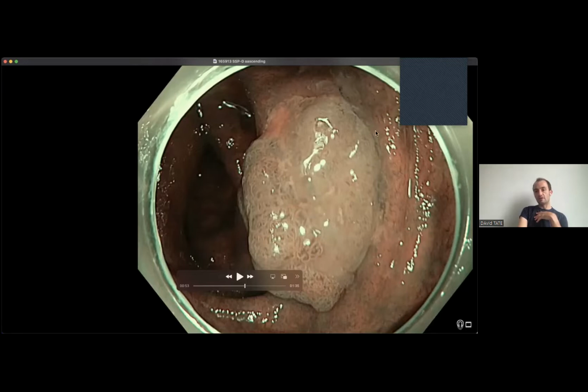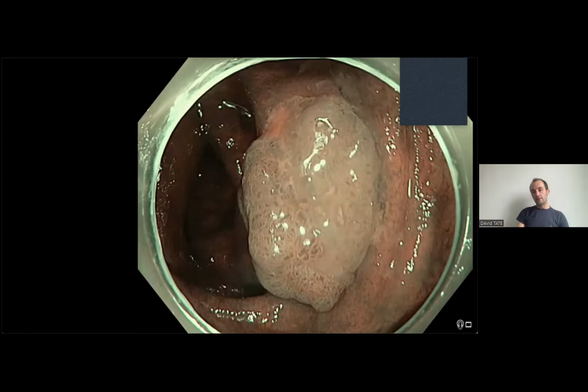And this is something that you sometimes see. They're dysplastic sessile serrated polyps. They are high risk for cancer. And they contain that nice demarcation between serrated polyp on the right and standard polyp on the left.